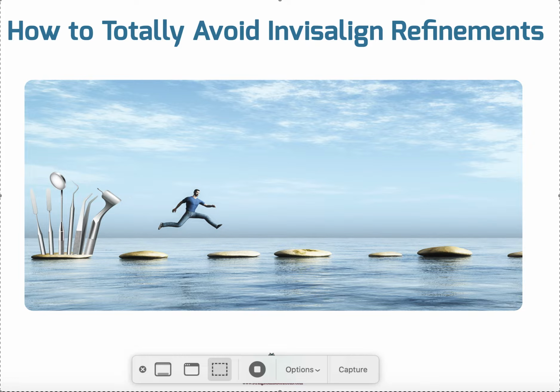And the more that seesaw effect is happening with the aligners, and they're coming in and out and in and out and in and out, they're really not wearing them enough. So hence the benefit of the smaller and more frequent stepping stones so you don't fall in. If you have smaller steps in between each aligner, it's almost impossible to get off track as long as the patient is checking in regularly, which is why I love virtual check-ins.